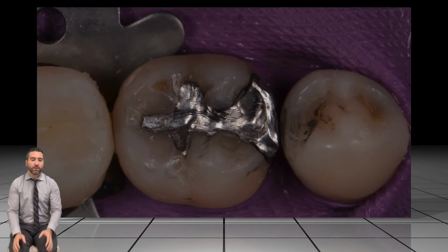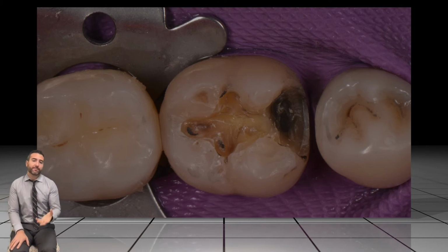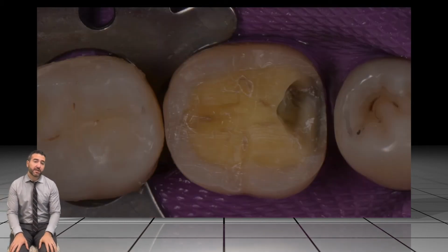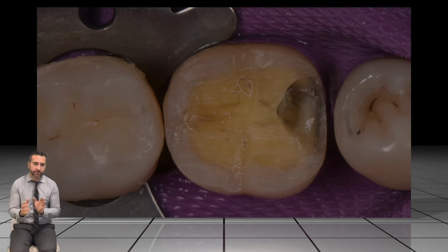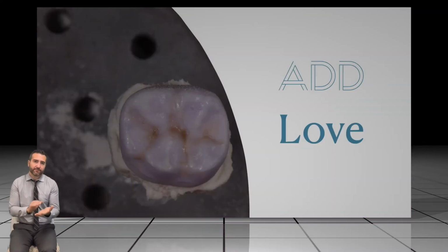So, you know, it's really cool to do same day dentistry and to be able to prep a tooth a little bit more conservatively and not have to prep for a temporary or anything like that. And we could use modern adhesive ceramics and, even using Emax or lithium disilicate, we could only have to reduce the tooth a millimeter for bonding that on.